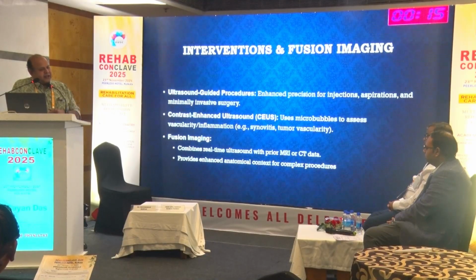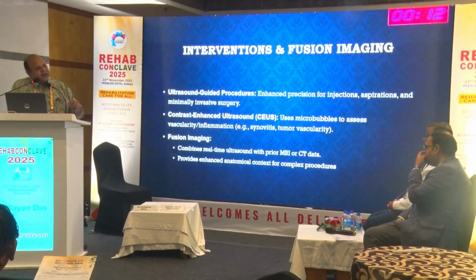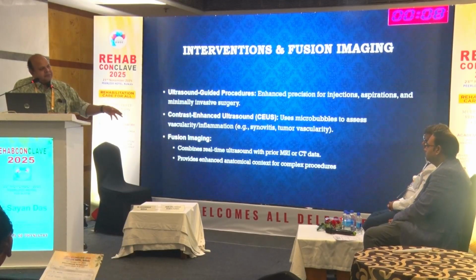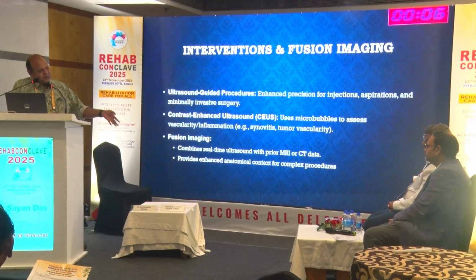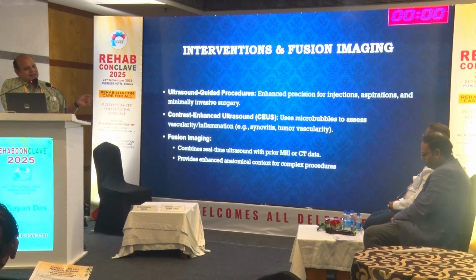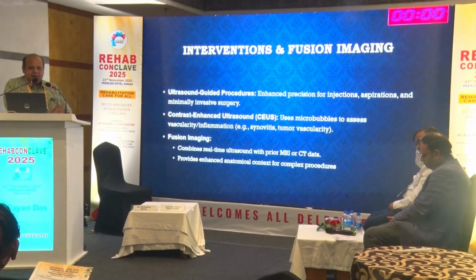Before that, I can check whether it is really the suprascapular nerve location or whether I am seeing something on ultrasound predicting a suprascapular nerve which actually is not. So on fusion images, we can actually see that and can precisely produce our therapeutic effect.